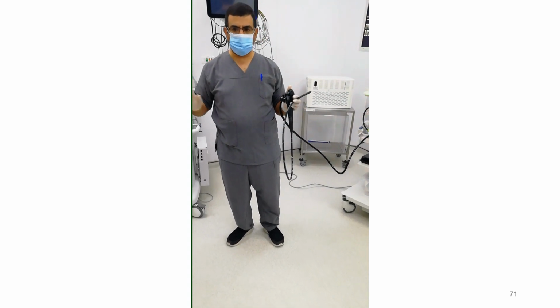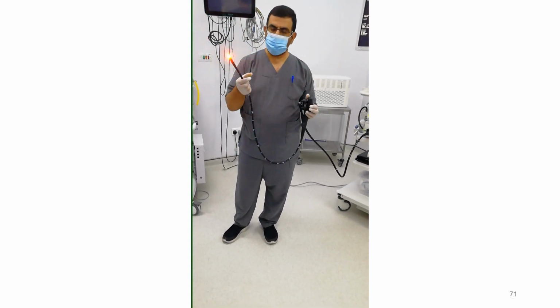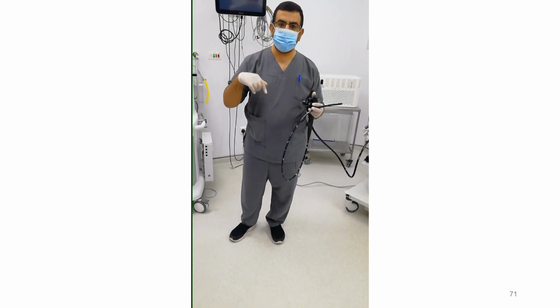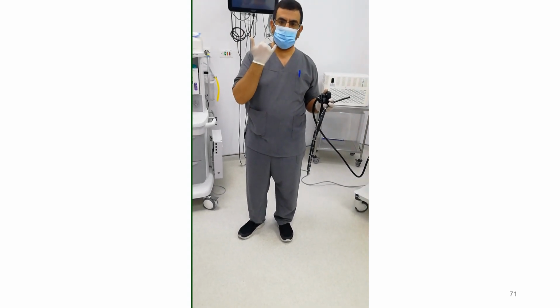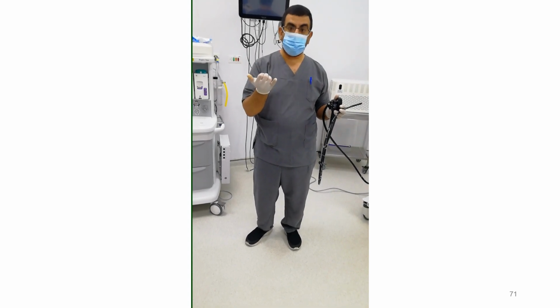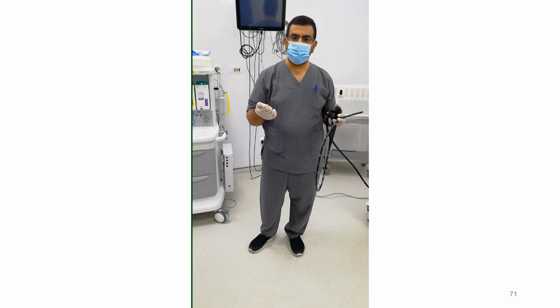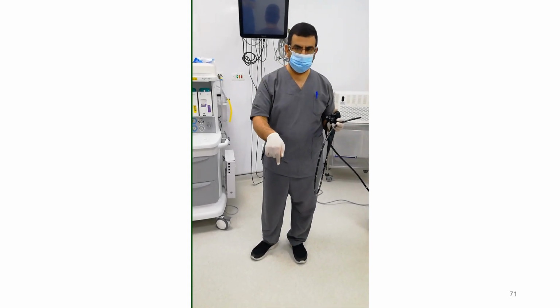قلب المنظار ده جزء أساسي، مفيش مشكلة. لكن حضرتك لما بتدي إير في المنطقة دي، حضرتك فتحت الإسوفجيال سفنكتر بإيديك، فلا إراديا بيحصل باسيف ريفلكس فوق من ضغط الهواء. السكريشنز دي بتوصل فوق لغاية اللارنكس، فبيجي له إحساس بالاختناق لأنه داخل على أسبيريشن. خد بالك من النقطة دي مهمة جدا جدا. فتلاقي العيان بيتهيج معاك جامد جدا، خاصة لو كان الفلويد ده بايل.